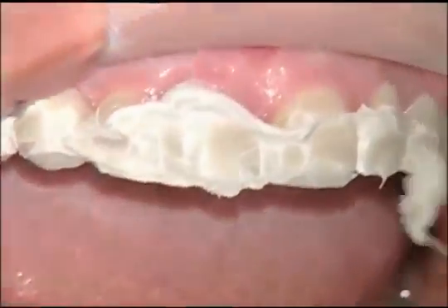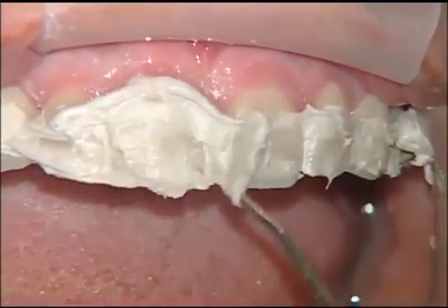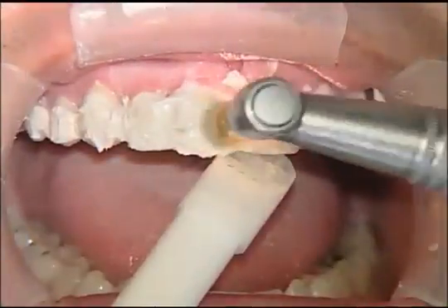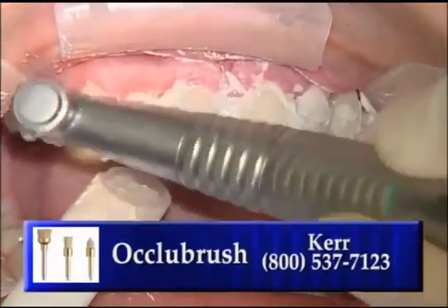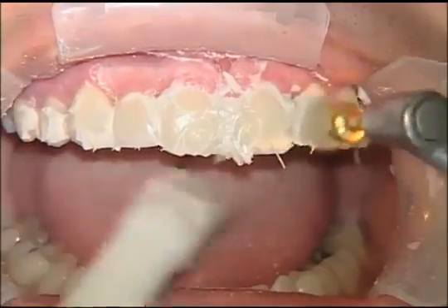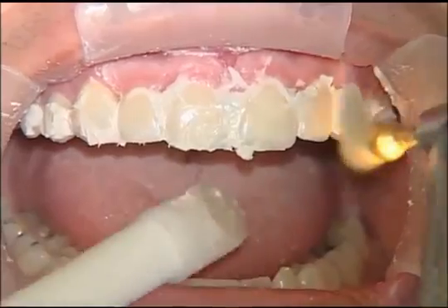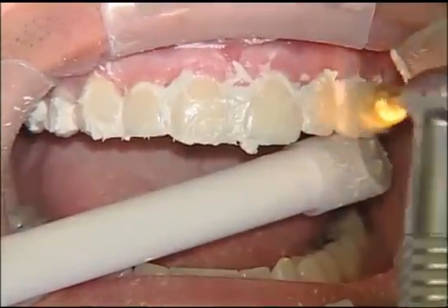After we finish polishing with the Brasseler Dialite series of wheels, we're going to go in with a product called Rapid Glaze, and we're going to place this on the facial surfaces of the teeth, and we're using an Oclu brush here. This is from Kerr Hawe. It's an aluminum oxide impregnated brush that goes in a slow speed. We're going to use this at relatively low speed, 5,000 to 7,000 RPMs. In the beginning, we're going to use heavy pressure and then lighter pressure to really put a nice high shine on the facial aspect of our ceramic veneers.